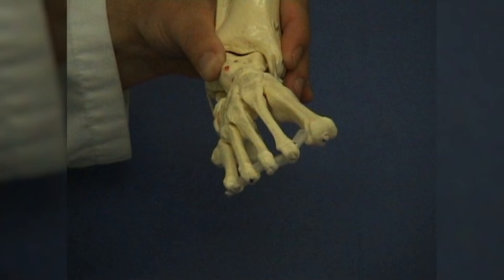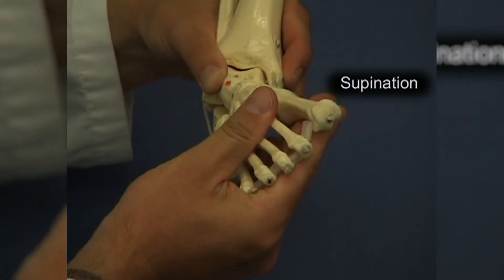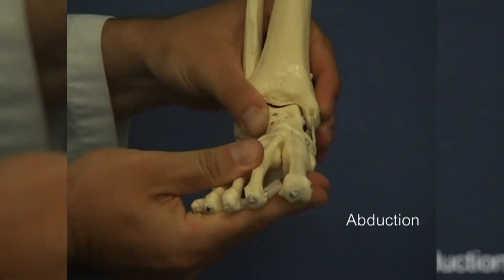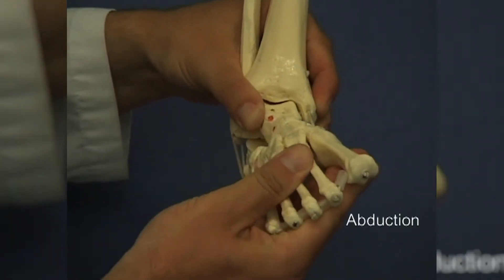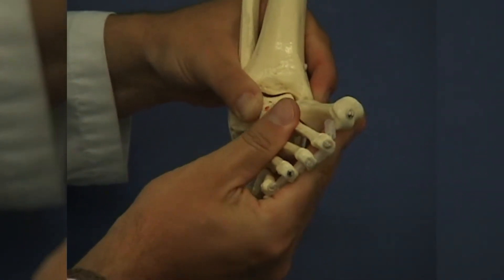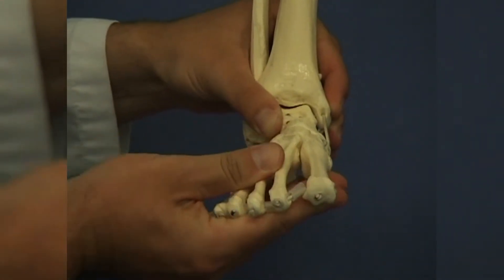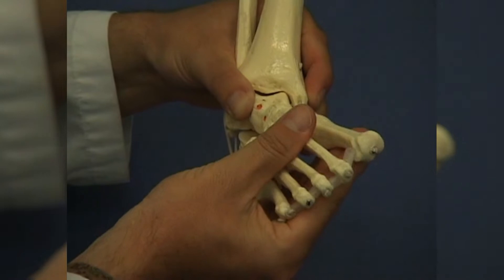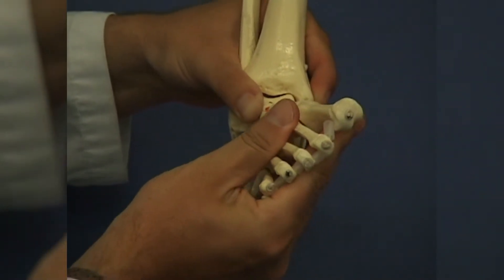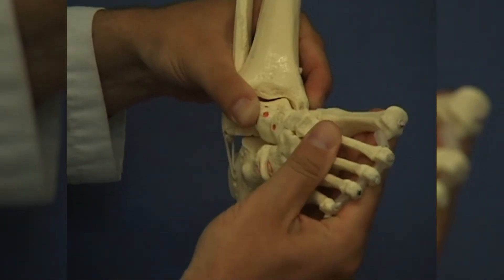Another important element in the Ponseti method is the direction of manipulation. The foot is first manipulated in supination and then in abduction. The foot is corrected against the fixed talus. The supination at the beginning of treatment is necessary to correct the slightly pronated position of the forefoot with respect to the hindfoot. When applying the first plaster cast, manipulation in this direction corrects the cavus foot component.